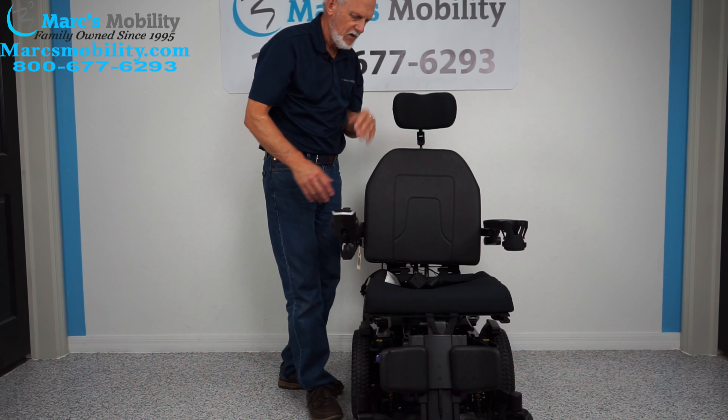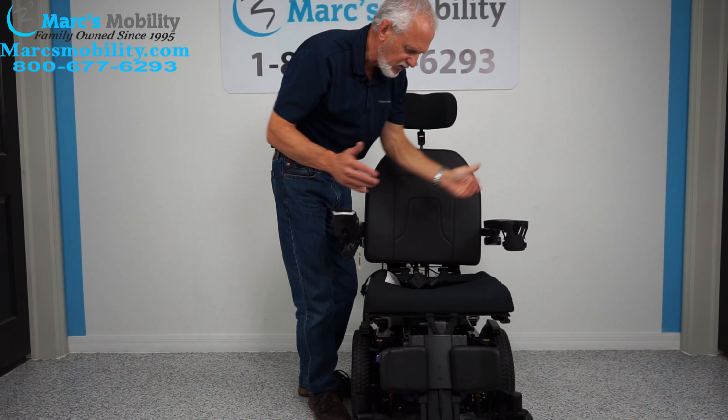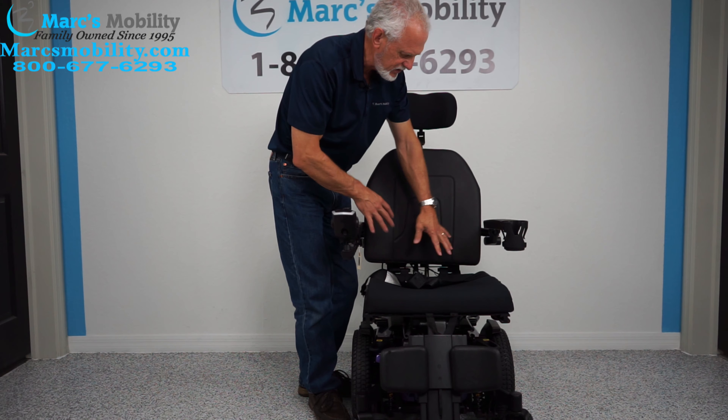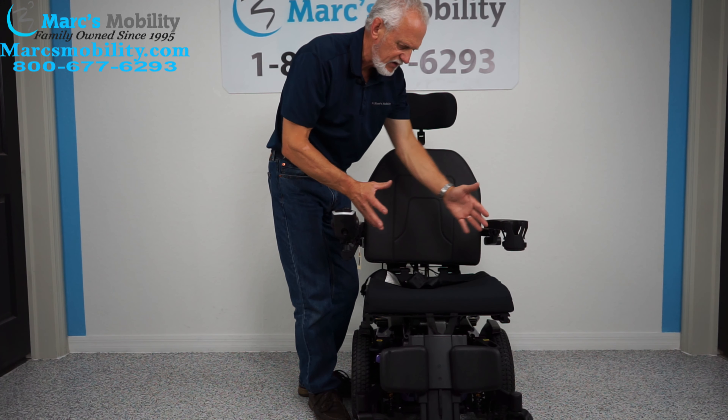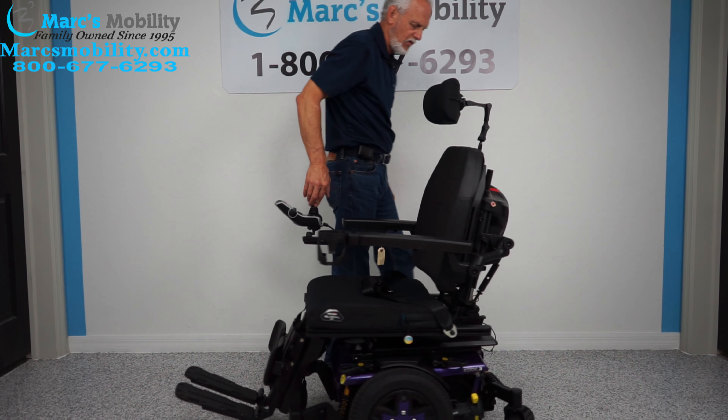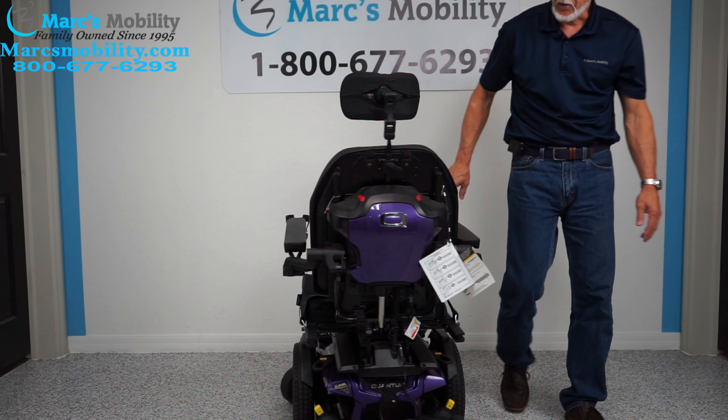The headrest is fully adjustable. If the seat is too big, too small, or too deep, we can adjust these seats. We have all kinds of cushions and we can adjust these seats to your size. This is a mid-wheel drive so it turns on its own length — you can see how well it turns.